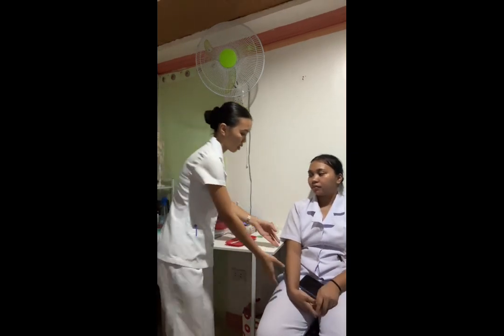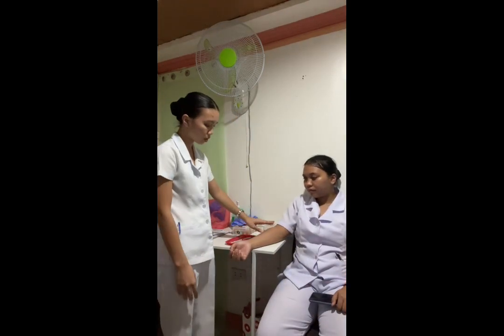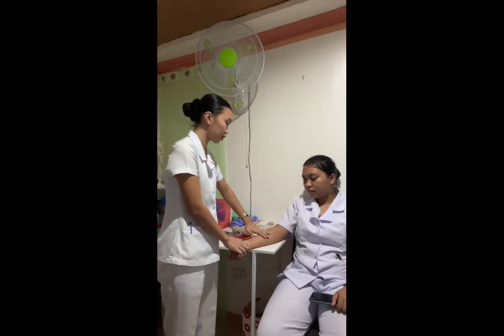So let me put your arm on the table. Okay, so we are going to inject the medication here in this area. So I'm going to inject the medication here, ma'am. Alright. And we have to avoid using sites that are tender, inflamed, or swollen, and those that have any lesions, because sites should be free from lesions, rashes, and moles.